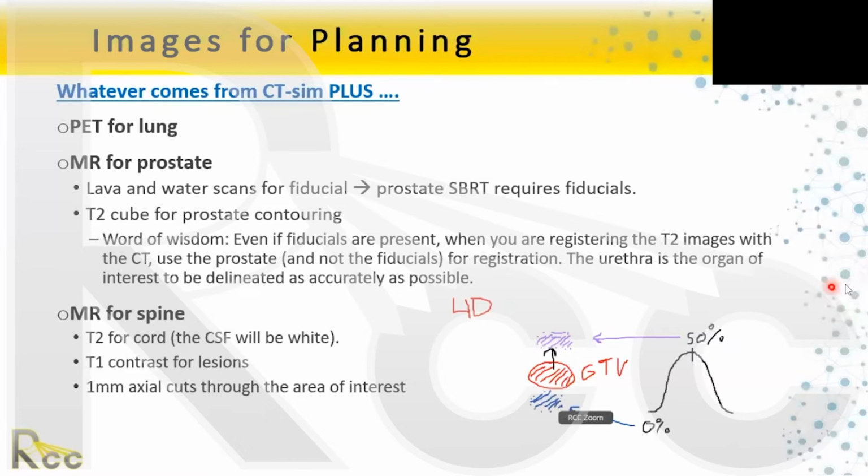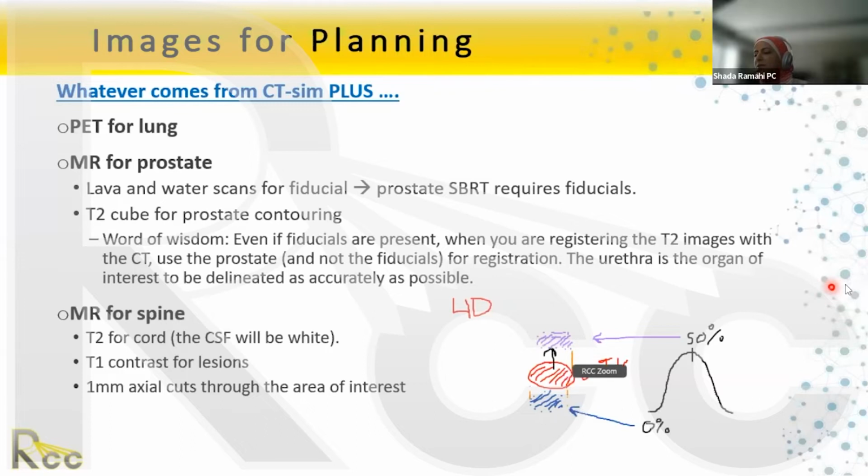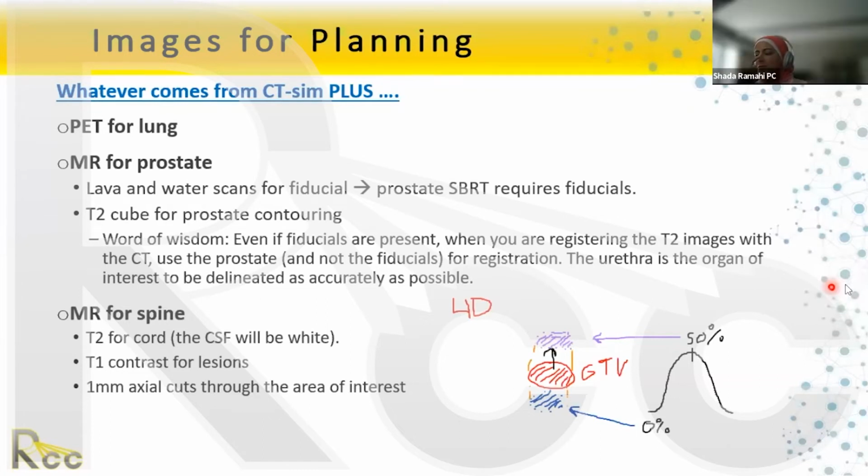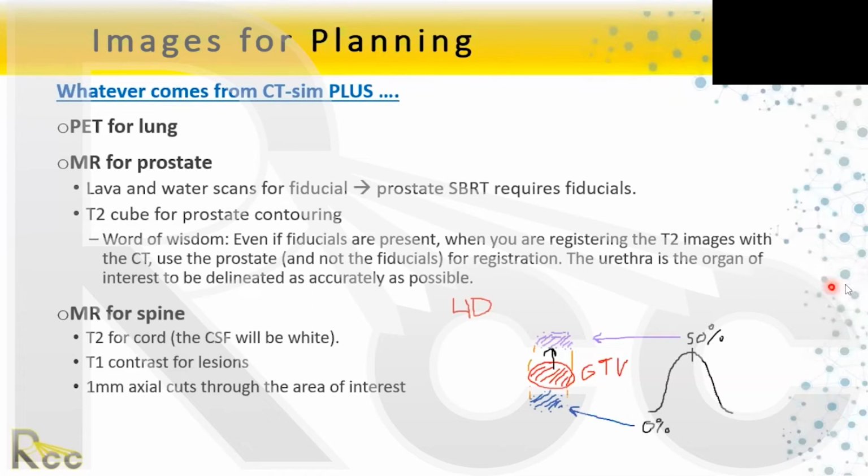After this, you'll probably want to interpolate to get everything in between. And this is going to help you have your ITV. One thing, we don't interpolate because some of the tumors do a helical motion. So at different phases, they would have different right, left differences, or anterior, posterior differences. It's not just one direction. So maybe I should say you want to fill in the gap. Interpolate might not be exactly correct.